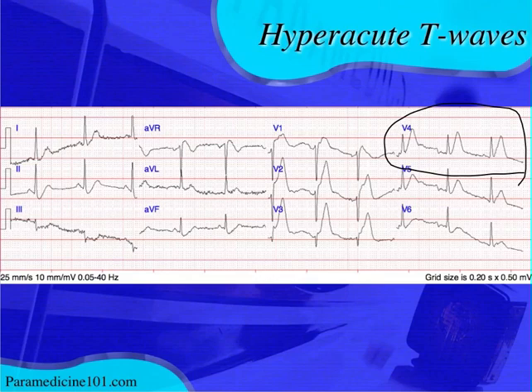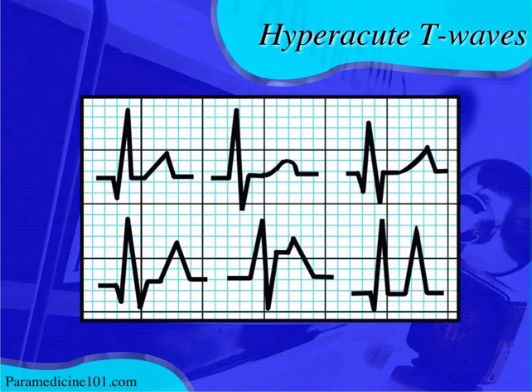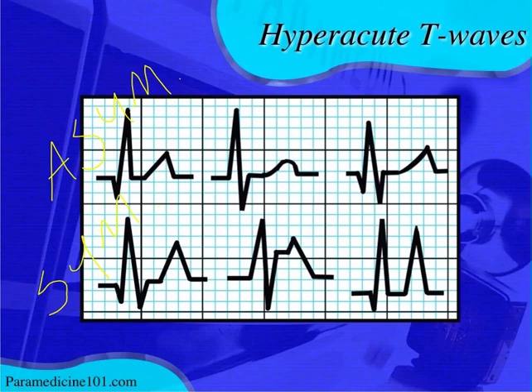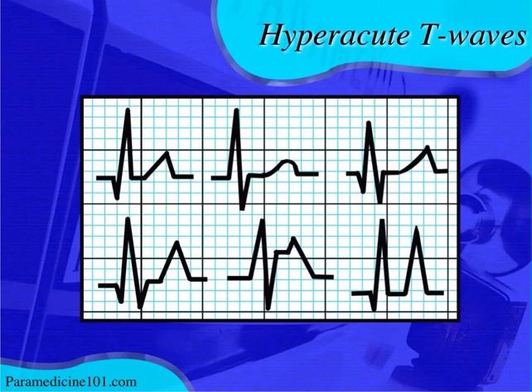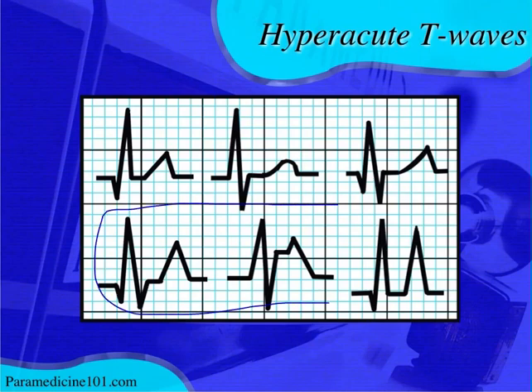The hyperkalemic patient, on the other hand, will feel weak, may have hypotension, and bradycardia is a very common arrhythmia — though hyperkalemia can mimic anything. Dr. Amonatu calls it the 'syphilis of cardiology' because it mimics just about everything. Here's an example of what I mean by symmetrical: across the top you see asymmetrical T waves, and on the bottom you have symmetrical T waves. Can you identify which is most like hyperkalemia and which are more hyper-acute? The narrow one on the right is the hyperkalemic-looking one — and the two broader ones are more similar to hyper-acute T waves.